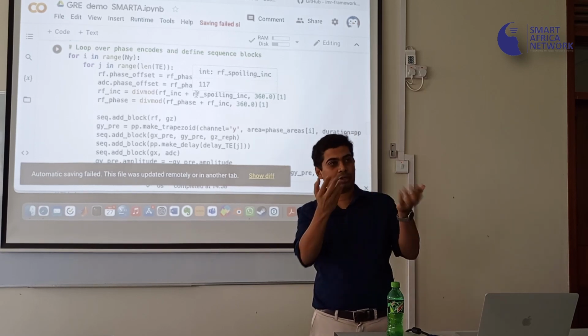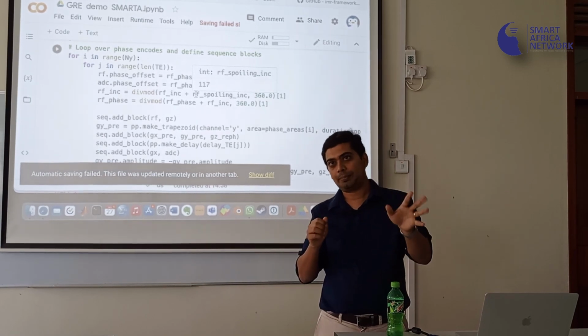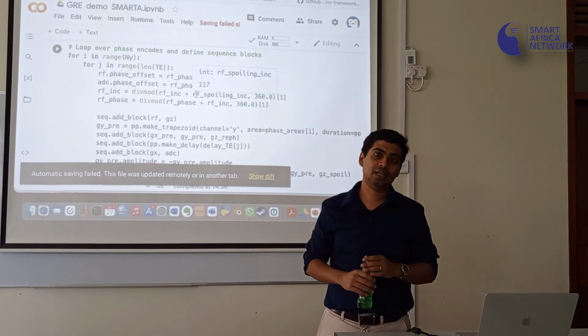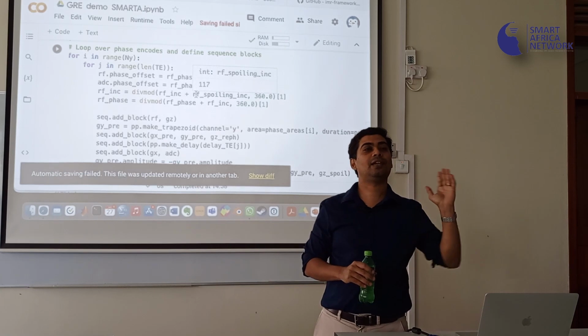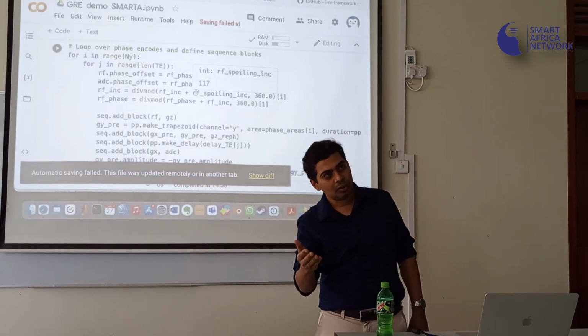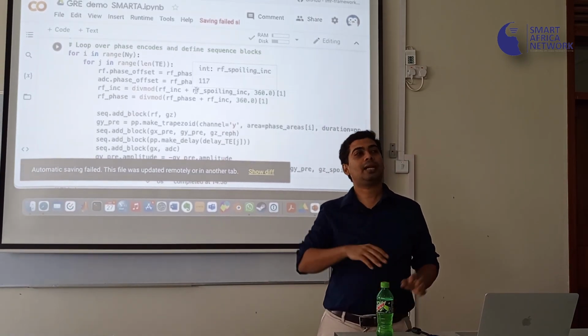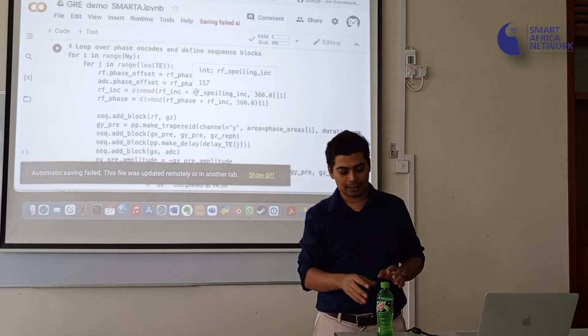Instead of the photons coming in, this is what frequency is in the object. You can imagine if there is something that's running very fast, you will get high frequency information. If something's moving very slow, you will get low frequency information. That's in time. You can have the same kind of motions in space as well.